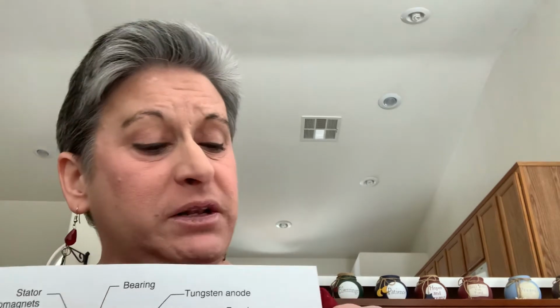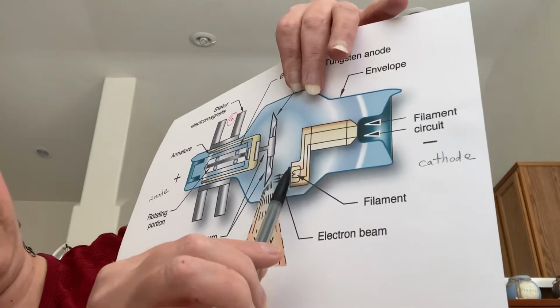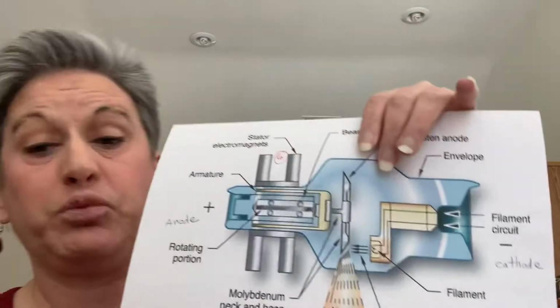The cathode assembly contains the filament or filaments, the focusing cup, and associated wiring. So we need the filament here, and the focusing cup is right here, and whatever wiring you need. That's part of the cathode assembly.